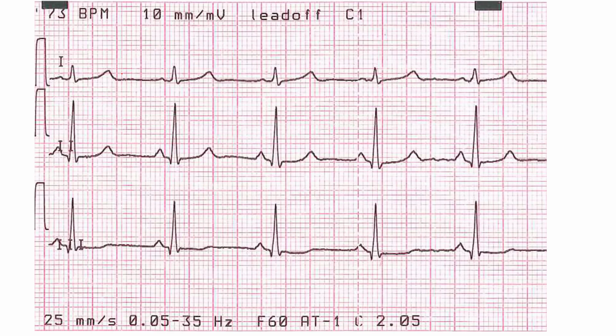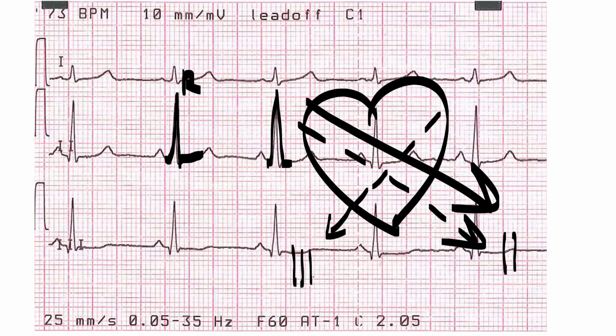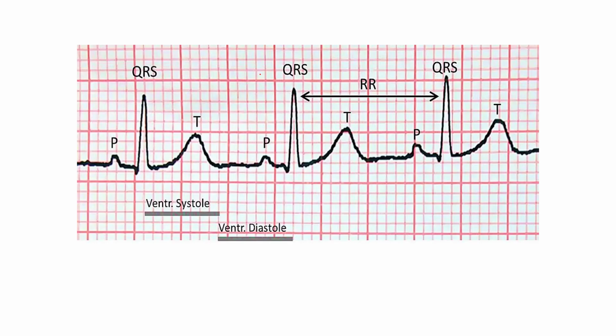Okay, what about when you're looking at the size of these signals? If you notice, lead 1 here is not a very strong signal, whereas in lead 2 and lead 3 you get really nice high QRSs. That R part of the QRS is a really nice tall positive response. That suggests the computer is getting a very strong signal, which suggests that your patient's heart is generating signal that's moving in the direction of that lead. In this patient, probably down to the floor, since lead 2 and lead 3, which are down to the right and down to the left, show you a good signal.